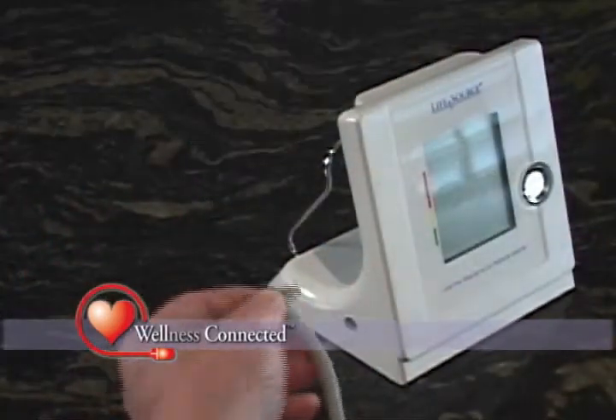All that's left to do is install the batteries and connect the cuff to the base unit. You are now ready to take your first reading.